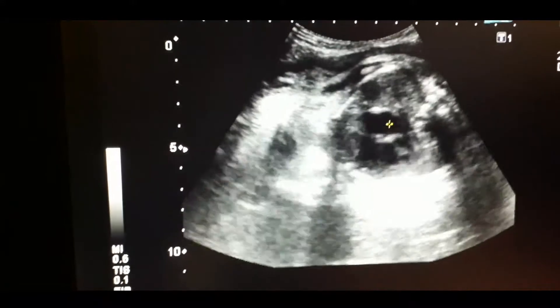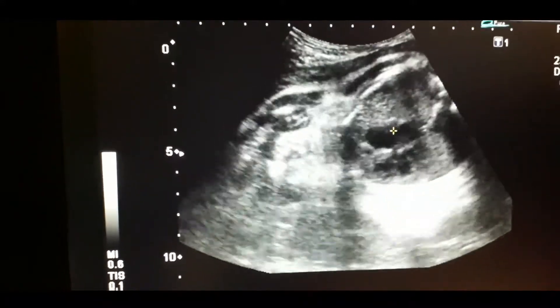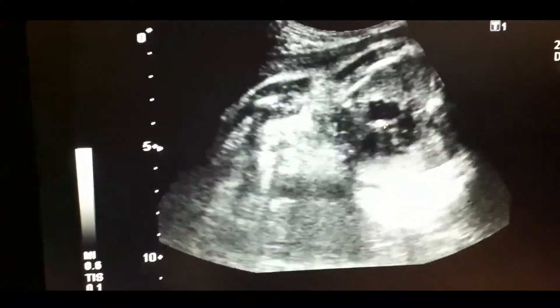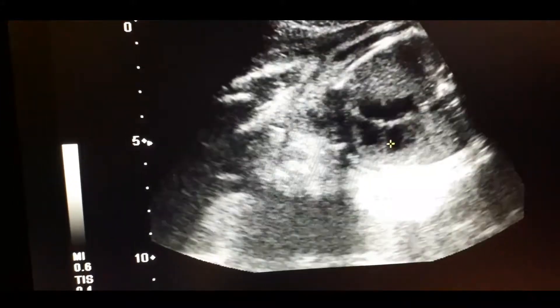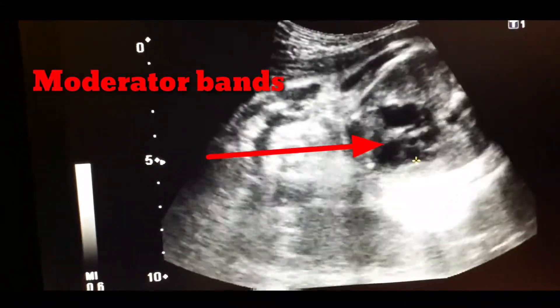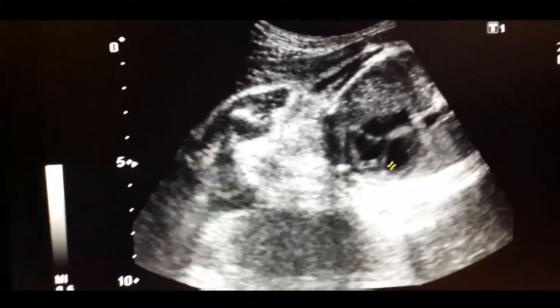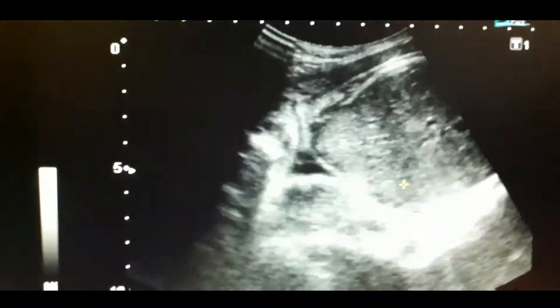There are two atria — left and the right atria — and then comes the ventricle. This shows the right ventricle, identified by the moderated bands, and this is the left ventricle. There is an interventricular septum as well.